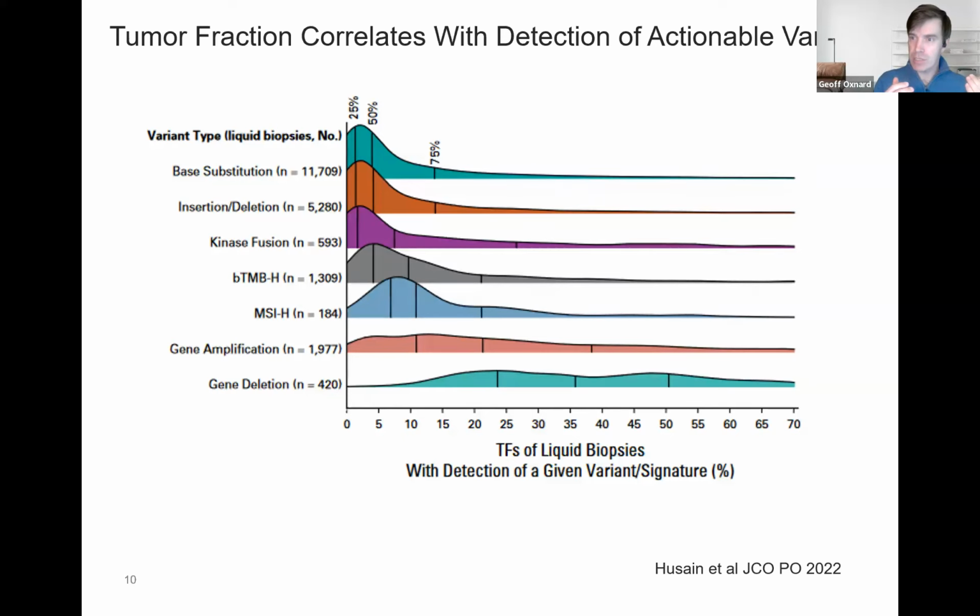But there are other patients who have modest symptomatology and modest tumor burden, where the level of DNA floating around in the plasma is quite scant or even negligible. The problem is you can't just hold the tube up and tell; you need some assessment of that level of shed, ideally from whatever assay you're using, that tells you this was a great specimen, full of DNA, so trust a positive, trust a negative.